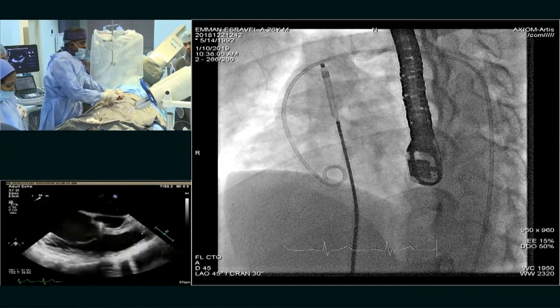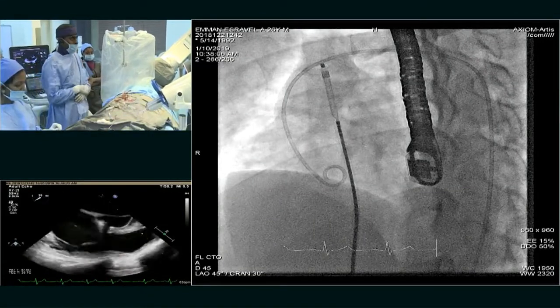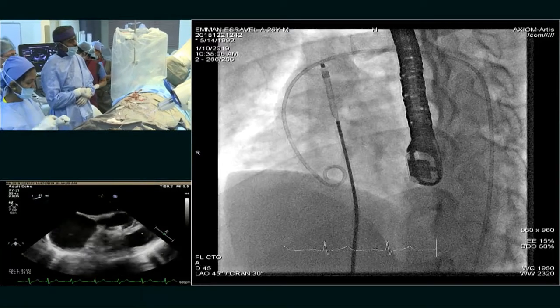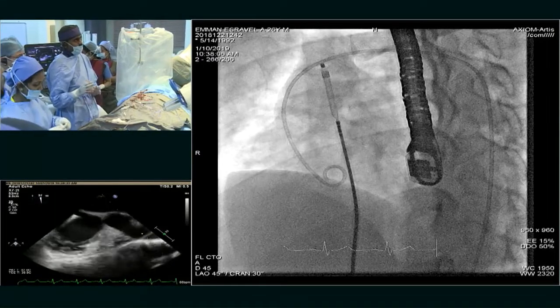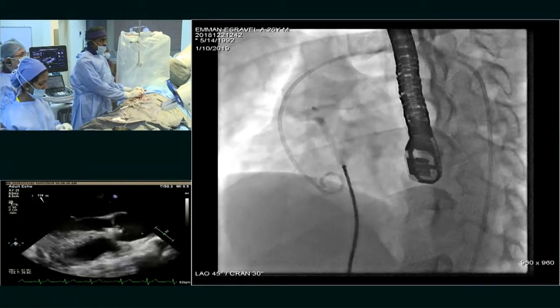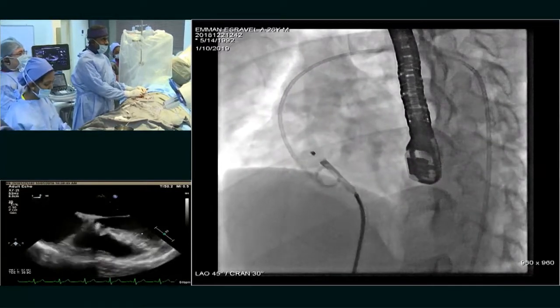Through the aortic valve, because this is a very soft device, Damian, I feel that it will possibly not cause a major problem for the aortic valve. In fact, there is a lot of literature, a lot of operators' experience even about a regular ADO1 device that is brought through the aortic valve to form the aortic retention skirt like a ball and try to get it down. So I feel it is reasonably safe on the aortic valve. And see, right now I am coming down, I have got a pressure monitor.